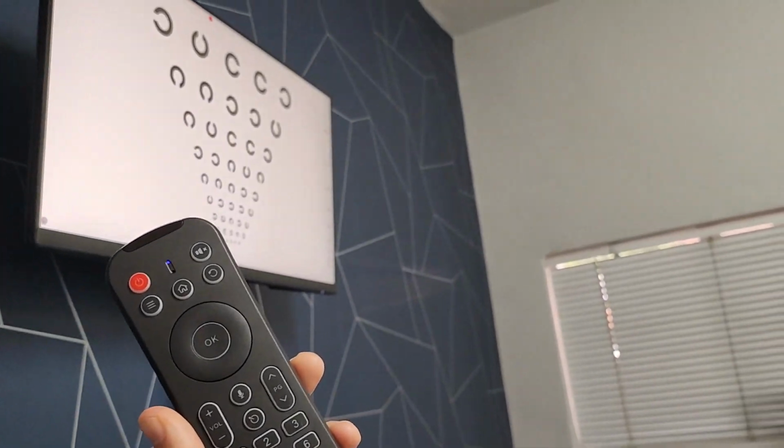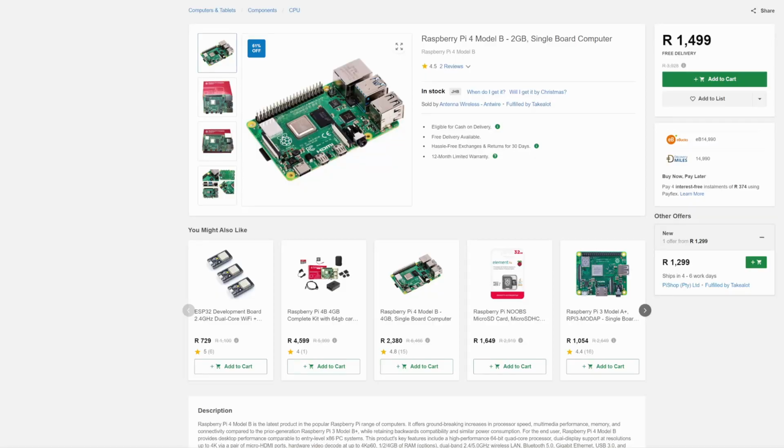Yeah, I mean, a Raspberry Pi is probably about, depends where you get them, 1,200, 1,300 Rand. Some of the quotes I got for charts were much closer to about, I don't know, probably closer to 30 grand. So what you need to build something like this.